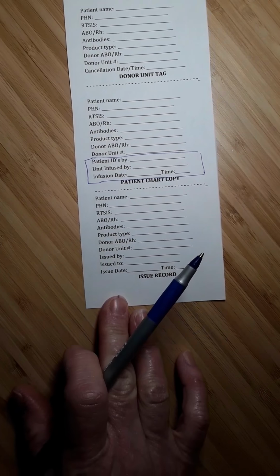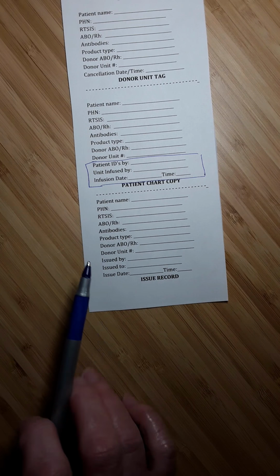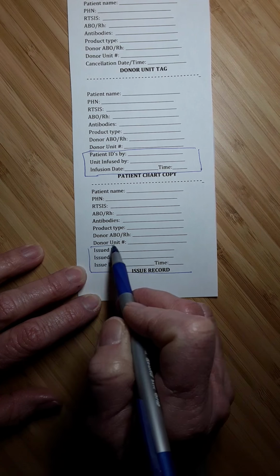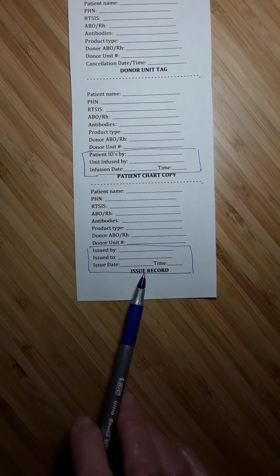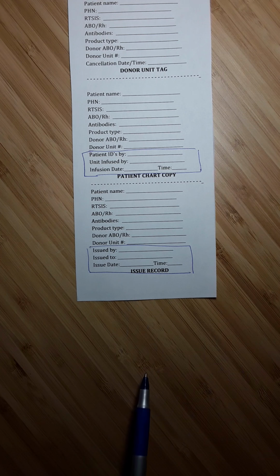This last portion of the tag, again, has the same information that we've described above. But in addition to that, there's a section down here that says issued by, issued to, and the date and time. And this is on a portion of the tag called the issue record. So when you get a call in transfusion medicine for a unit of blood on a patient, you will do the cross-match. The tag will print, and you'll stick this tag on the unit of blood.